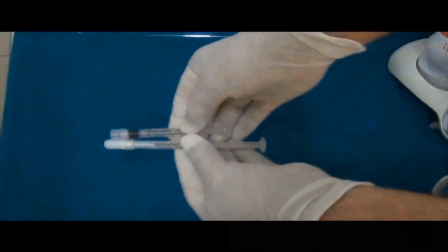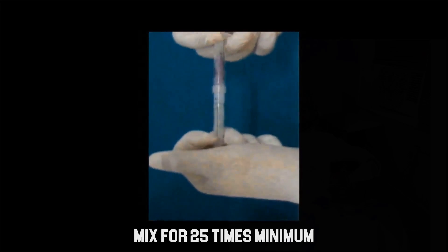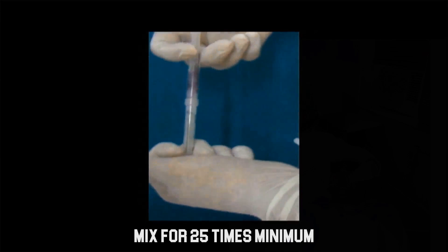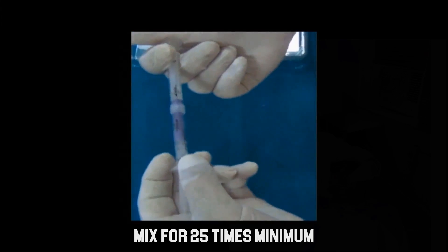Connect the two syringes together by twisting one syringe onto the other until fully tightened. The two syringes containing the base and the activator gel are mixed. Depress the plunger, forcing the contents of the base syringe onto the activator syringe.